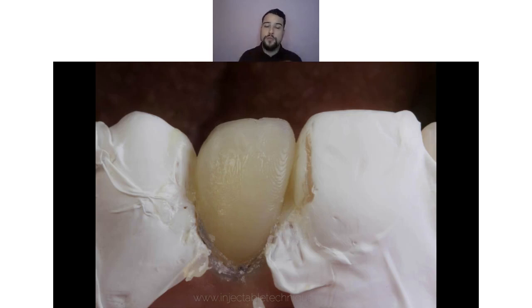I'm always trying to follow the single veneering concept, and in the masterclass I am explaining, in multiple veneers, how you can make this single veneering concept in an analog but also in a digital way. When following the single veneering concept, you have a small amount of excess on interproximal surfaces, as you can see here, but it is very easy to remove it.